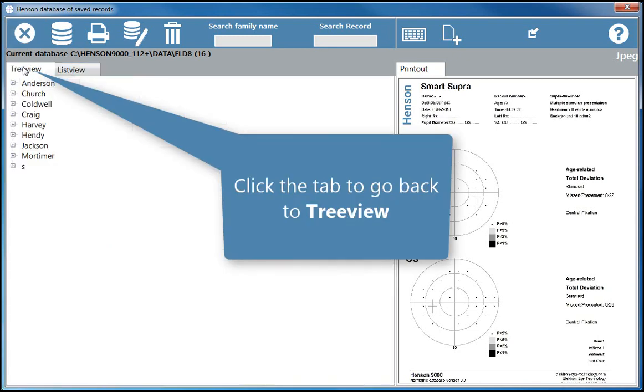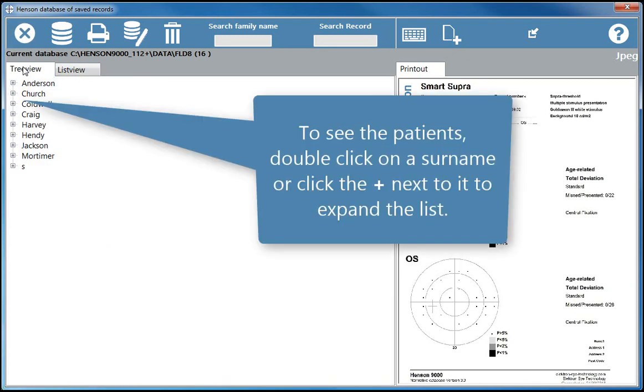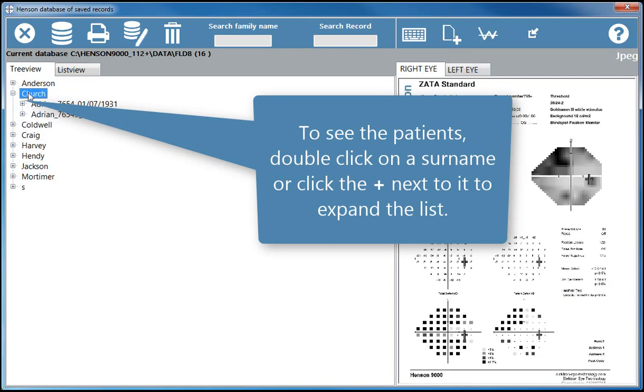Click the tab to go back to tree view. To see the patients, double click on a surname or click the plus next to it to expand the list.